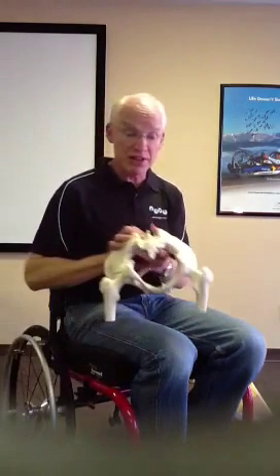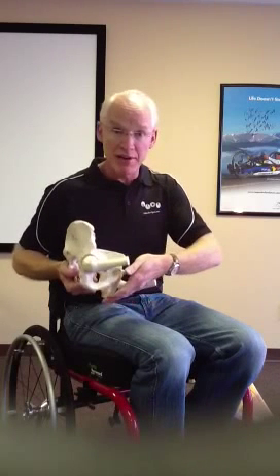The idea is to optimize and increase loading of viable soft tissue, typically proximal thigh in balance with posterior lateral buttocks. By increasing the forces of support at areas of the body tolerant of pressure and shear, we can then remove contour or take contour away from the body at areas at risk, specifically ischial tuberosities, coccyx and sacrum, greater trochanters, and the perineum.